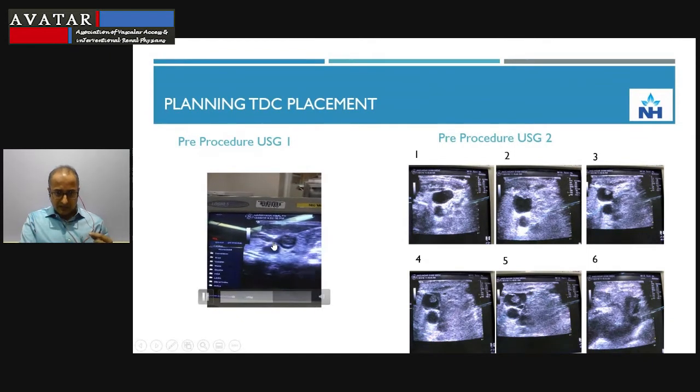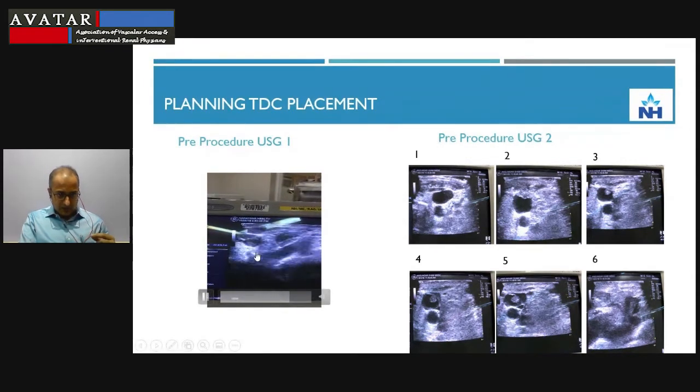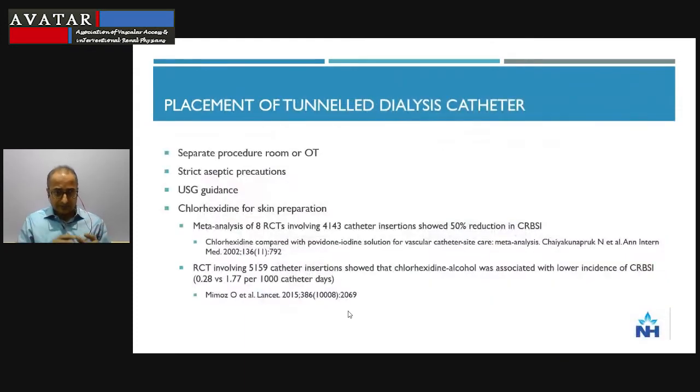And this pedunculated mass, this thrombus, extends all the way into the bottom of the vein and into the subclavian vein where the IJV joins the subclavian. So that is not a good sign as well. You can see this mass extending into the subclavian vein. So in this patient, you should not be doing the procedure without C-arm guidance and without a micropuncture set.